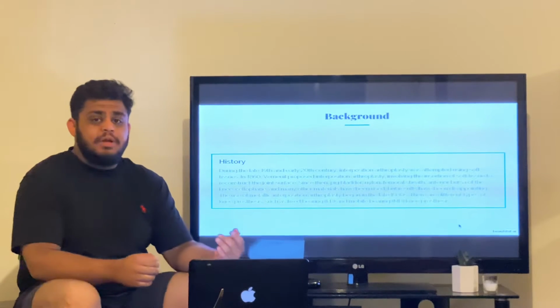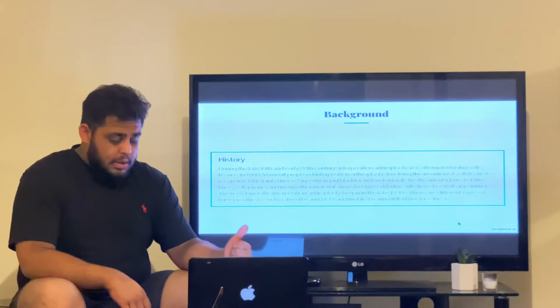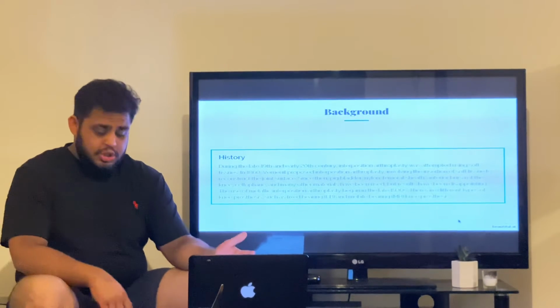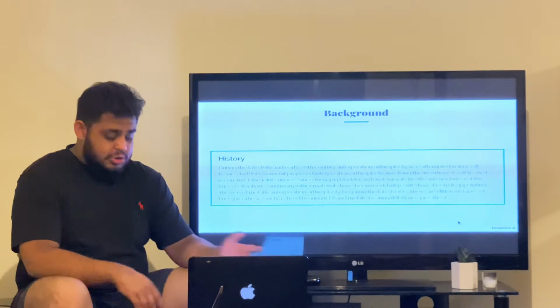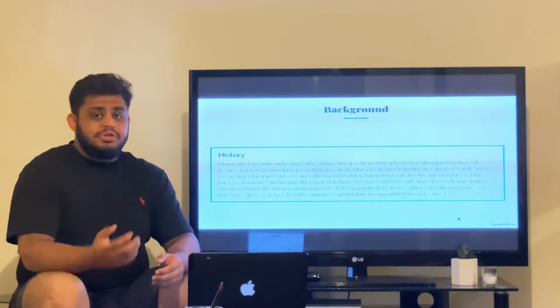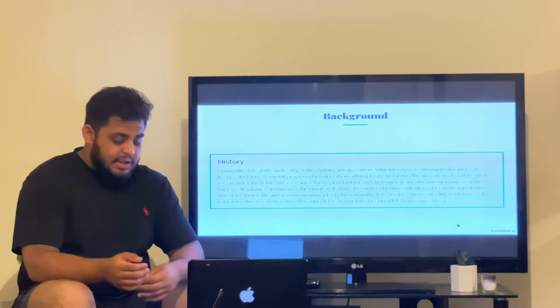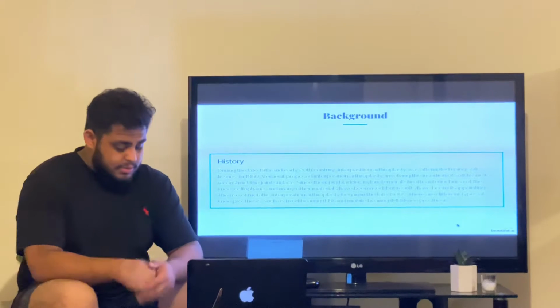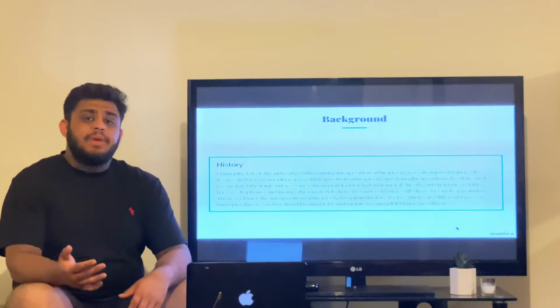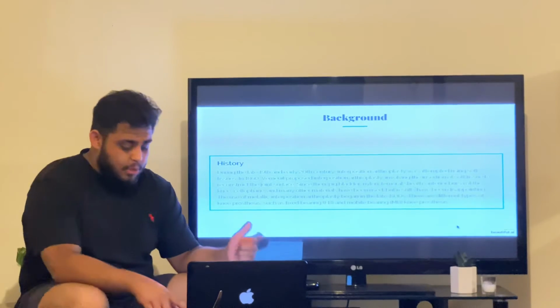Now, a lot of different materials are used for this procedure. Pig bladder, nylon, femoral sheath, anterior bursa of the knee, cellophane, etc. But the results are always disappointing. The use of metallic interposition arthroplasty began in the late 1930s. Now, there are two types of knee prosthesis, the fixed bearing prosthesis and the mobile bearing prosthesis.